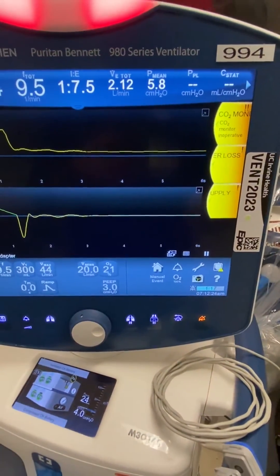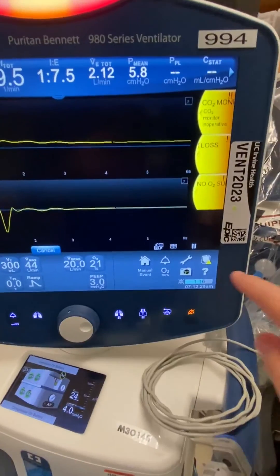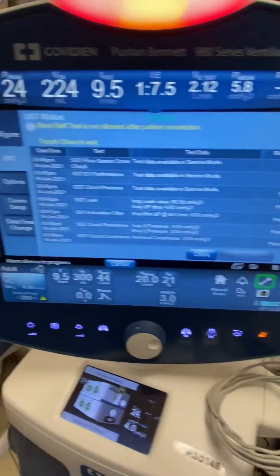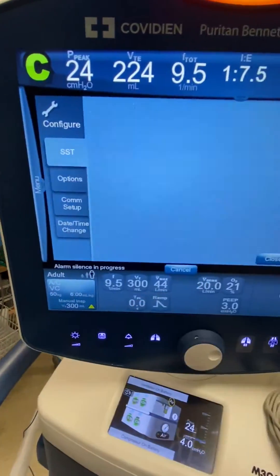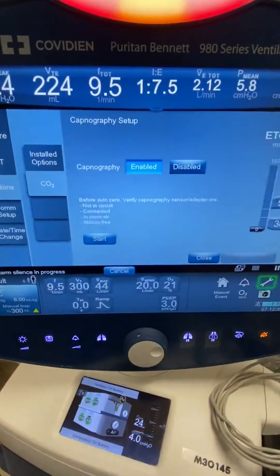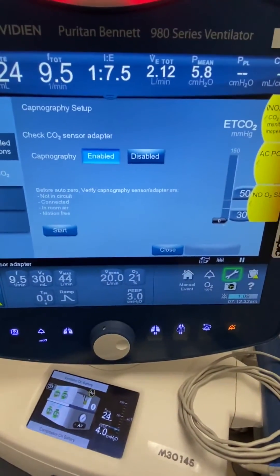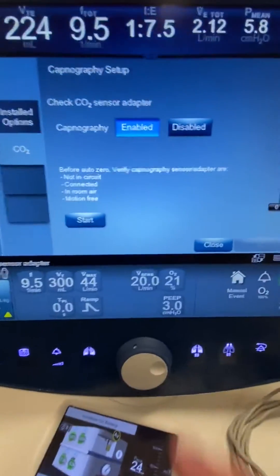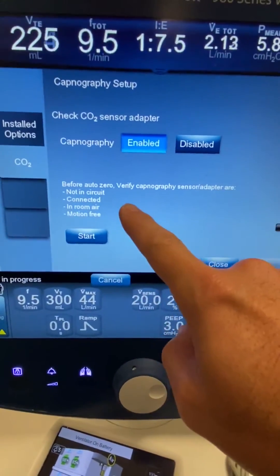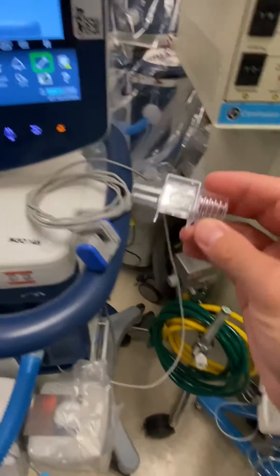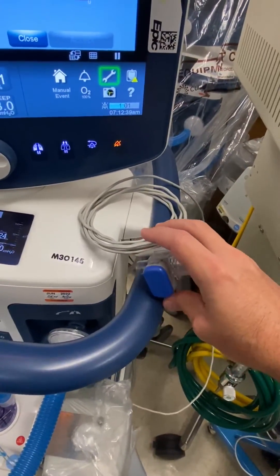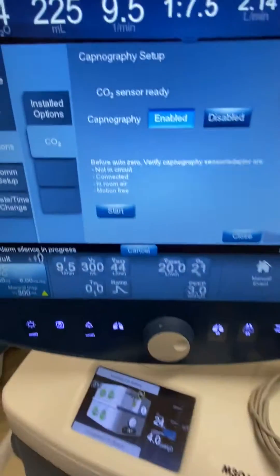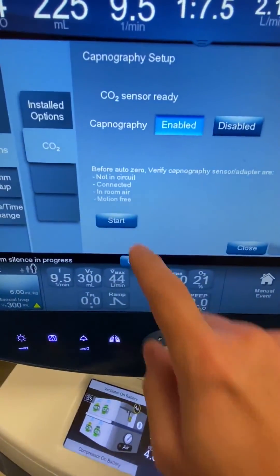Now that it's enabled, you have to go back into the wrench, and this is how we're going to zero it. So we're going to go back into Options, CO2, and now we want to start our zero process. You're going to need your cuvette, and that's going to go right in line here, snap in, and then you're going to hit Start.